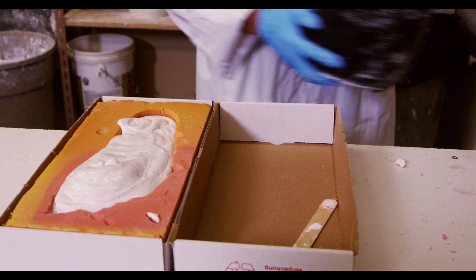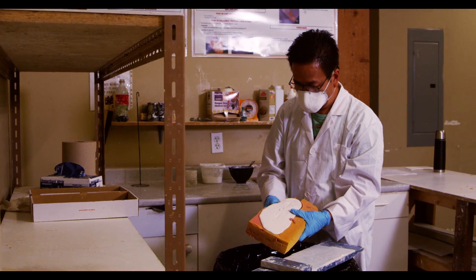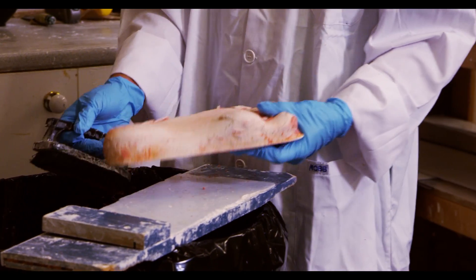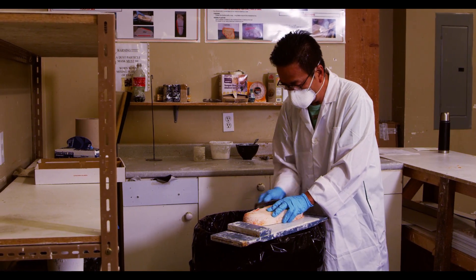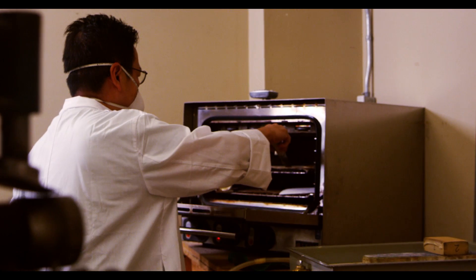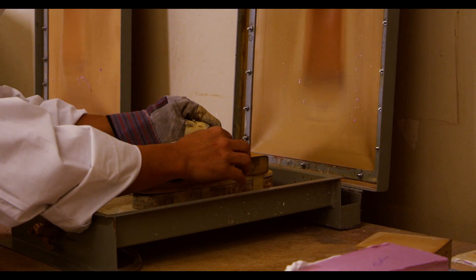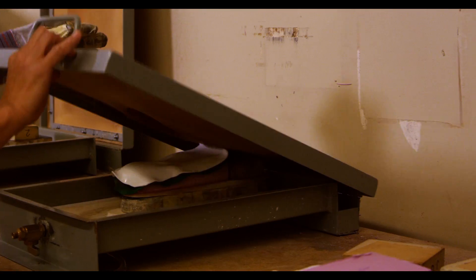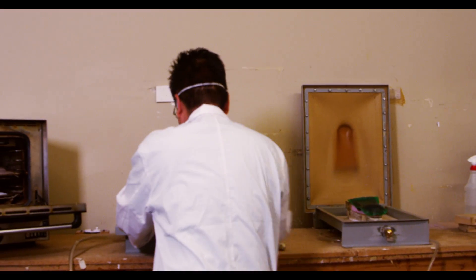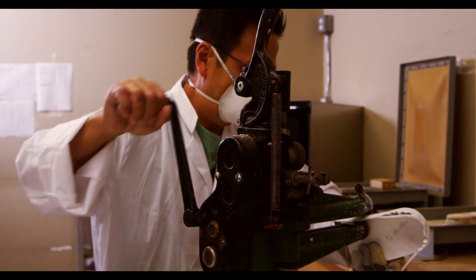Here we see the technician filling a cast with plaster. Once the plaster has hardened, it will be smoothed and modified in ways similar to what is done in the CAD CAM system, but by adding or removing plaster instead of manipulating a digital shape. Once we have a corrected model of the foot, the raw material of the orthotic shell is heated until it is flexible and then pressed around the model using a vacuum press.